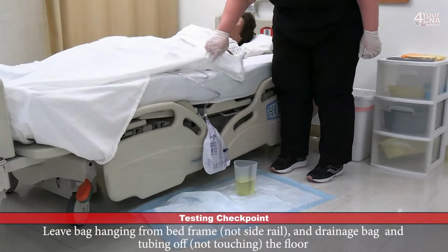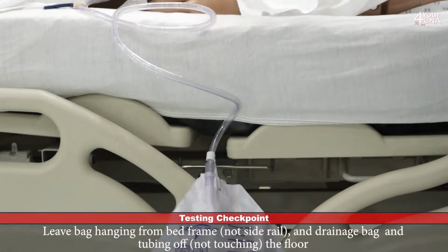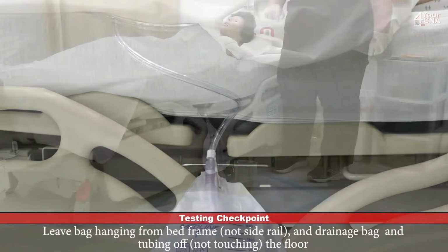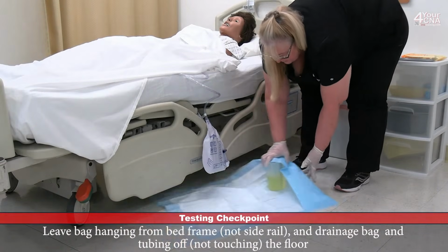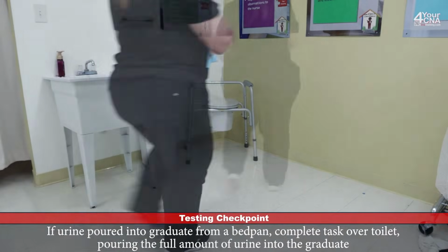All right, Ms. Jones, I just want to check to make sure the tubing is coiled on the bed and you're not lying on it, and that it's not coiled near the floor either, where it could become a tripping hazard. Now, I can wrap the chucks around my graduate container for safe and secure transport to the bathroom.